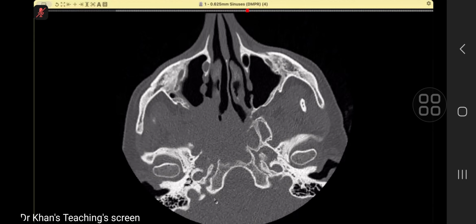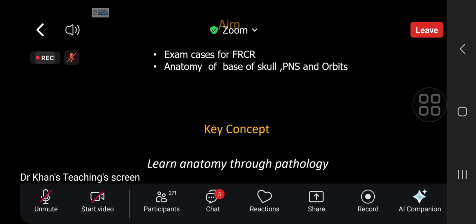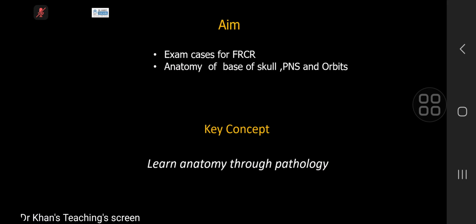So let me go through this case. I will do a bit of normal anatomy teaching and then go through the case. Each candidate today is going to get a single case. So thank you very much, candidate one. I'll give you the feedback after my teaching. There is no need of waiting, but you can listen.